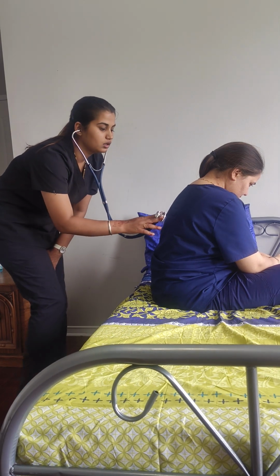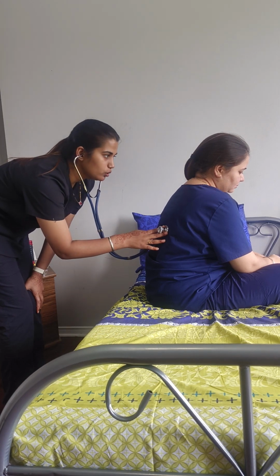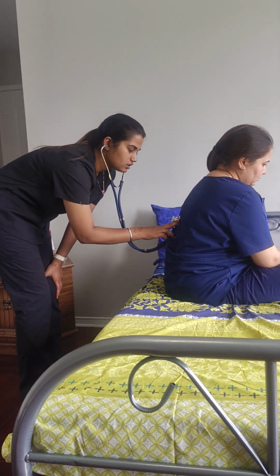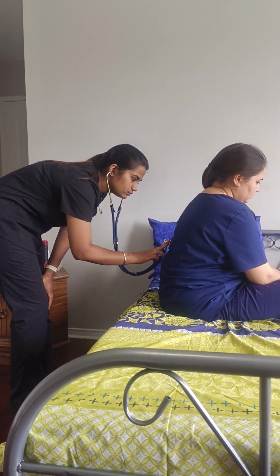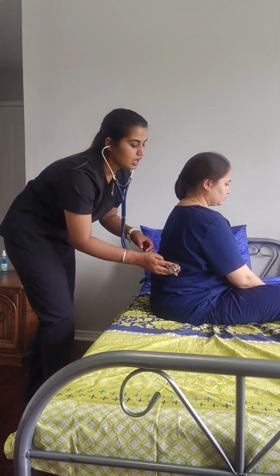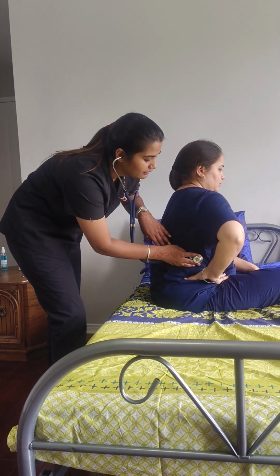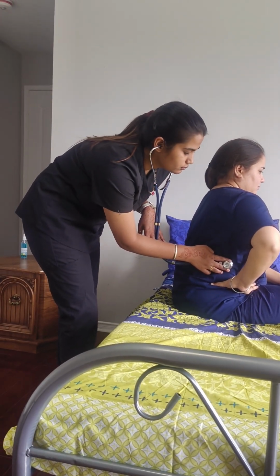Now at T3 to T10 for the auscultation of the lower lobe at the right side. Now at the left side to auscultate the lower lobe of the left lung. Now, to hear the lateral side of the lung, I will ask the patient to take a Superman position and at the mid-axillary line at the level of T10, I am going to auscultate for the lateral side of the lung. From the other side too.